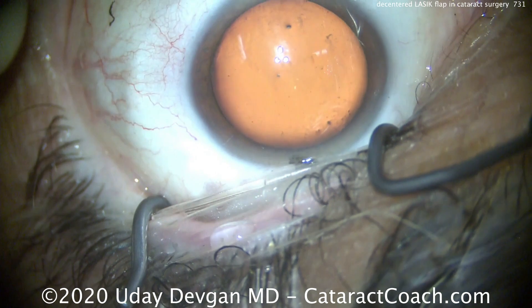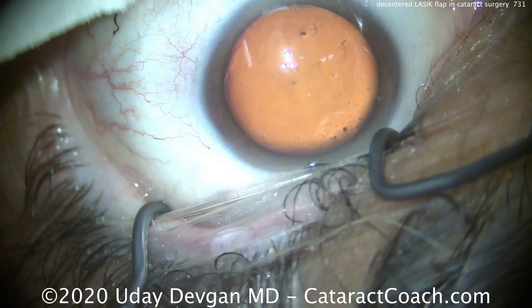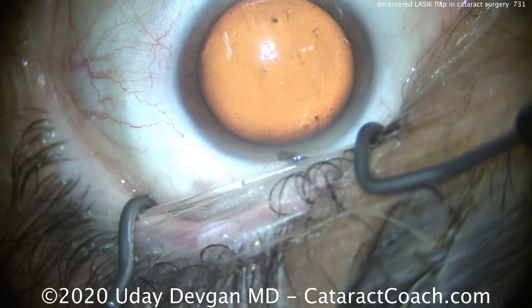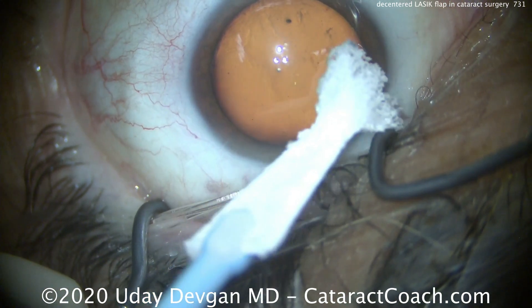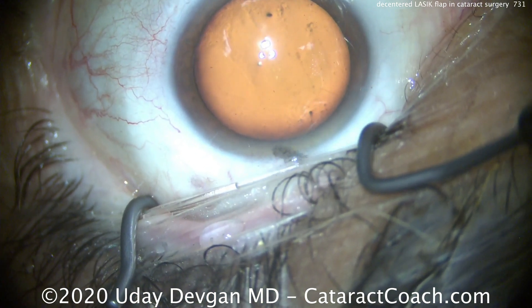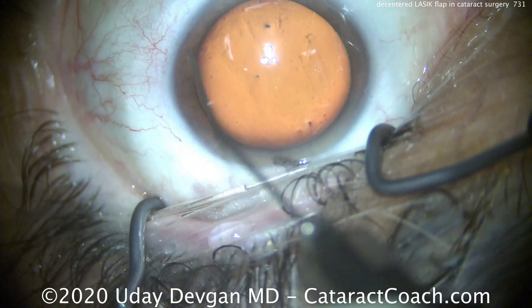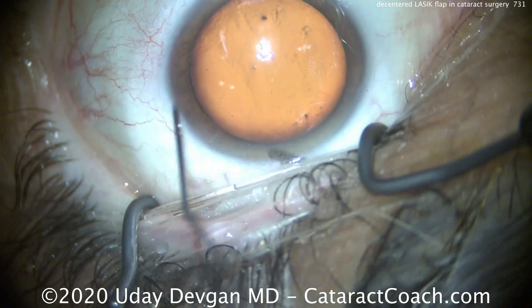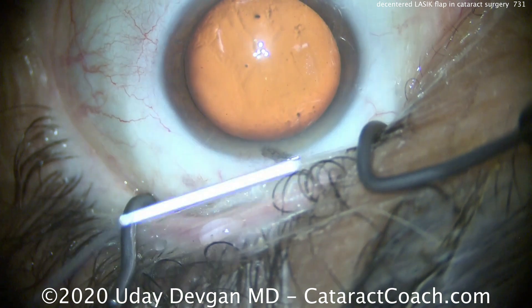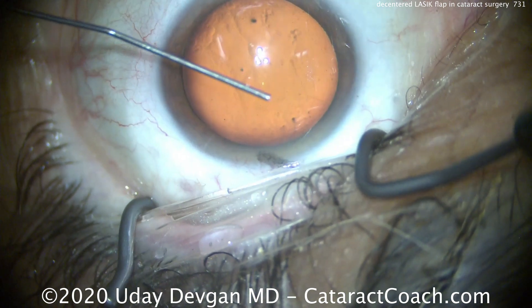This patient had LASIK about 20 years ago, and with that red reflex, we're looking to find the LASIK flap outline. You can see a little bit of it — look carefully. This dry Wexel sponge is going to help to delineate that. A helpful hint to see the LASIK flaps: let the eye dry out, and then gently touch the cornea and depress it very gently.